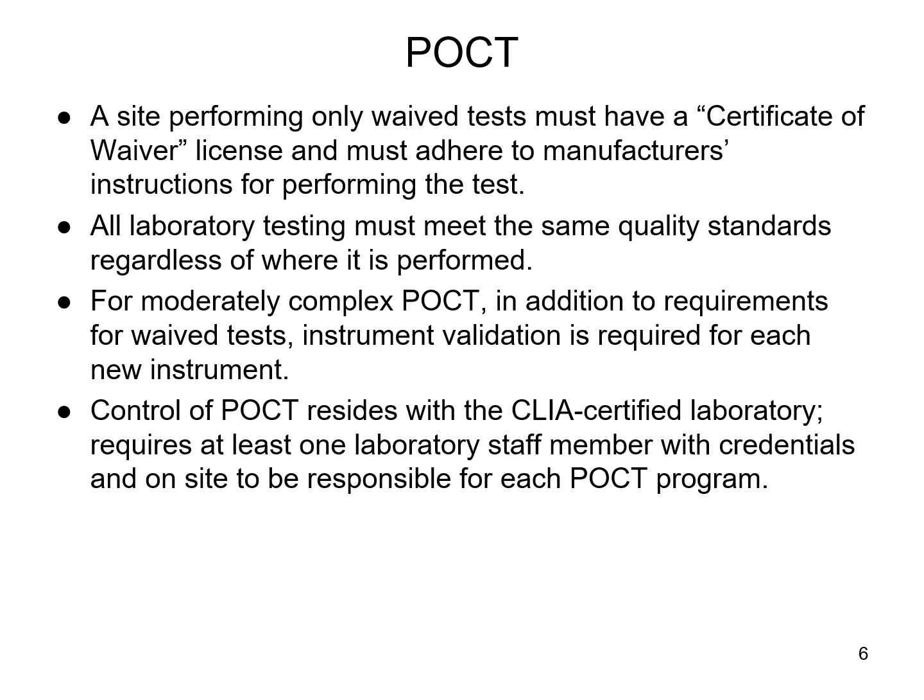Now for moderate complexity testing, that's considered in a point of care setting, there can be some additional requirements that are a little bit above what the waived testing requirements are. And this would include things like instrument validation, quality control, any sort of method validations or anything like that that are required for typical moderate complexity testing.